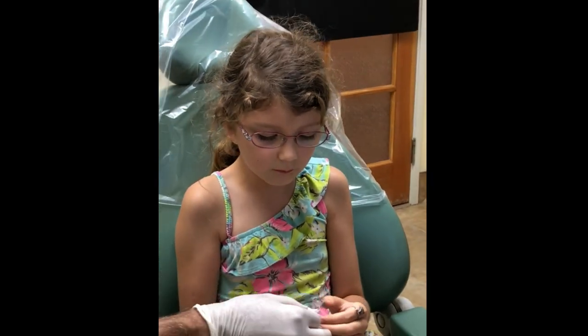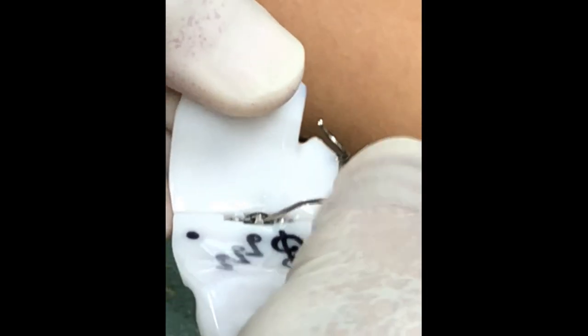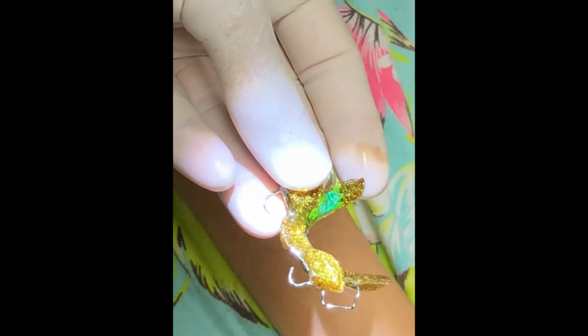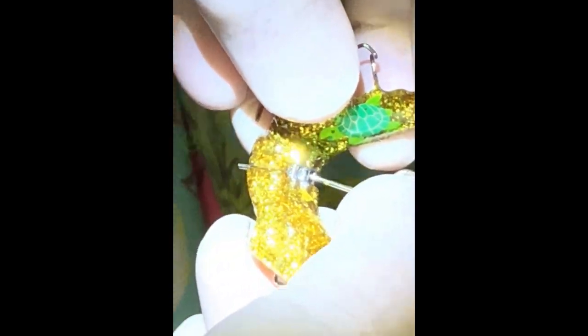This one is done. Now we're gonna show you how to activate it. You're gonna insert the key here and turn it — that's one turn, from the front to the back. Three days later, insert the key and turn it backwards until it doesn't go anywhere. Three days later, find the front hole again and turn it back one turn.